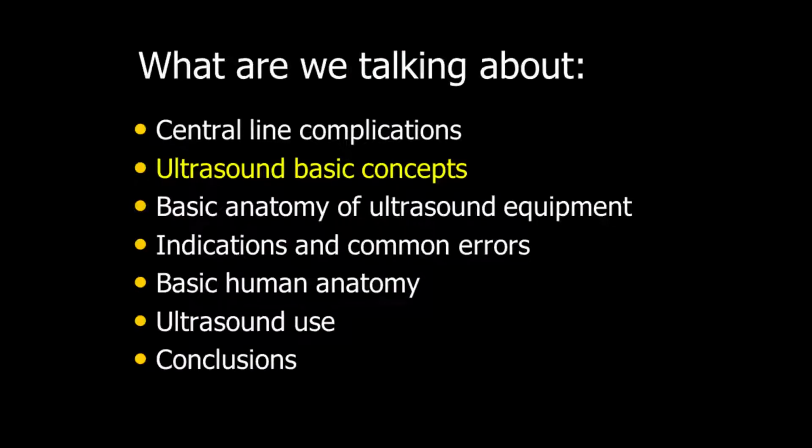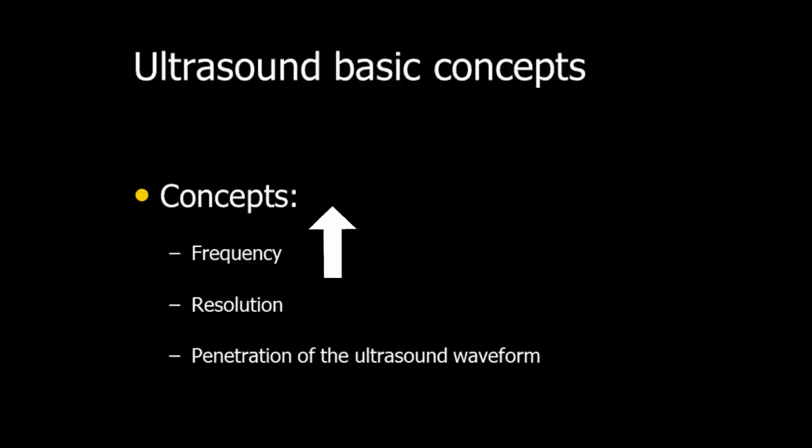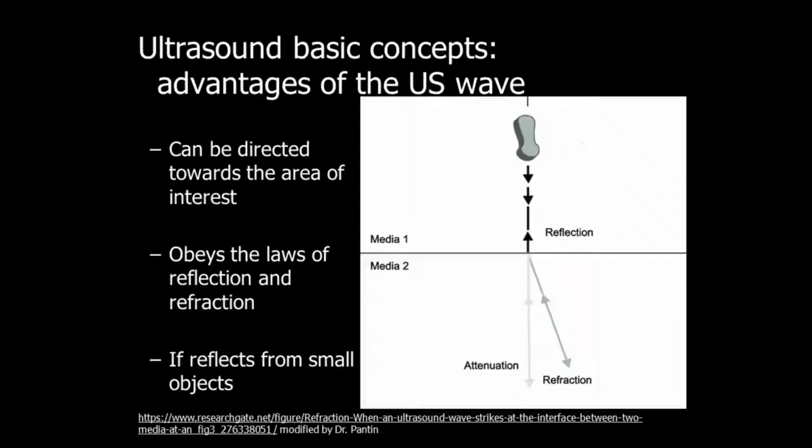Some basic concepts of ultrasound. We're going to talk about frequency, resolution. Higher frequency, higher resolution, but less penetration of the signal. So that's important. The more perpendicular to the structure, the better the image will come to the probe. And there is always some refraction of the signal, of course.